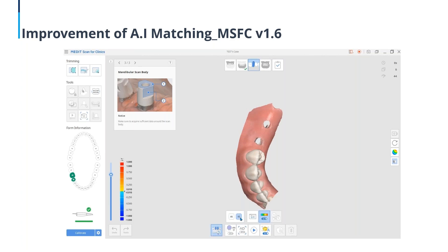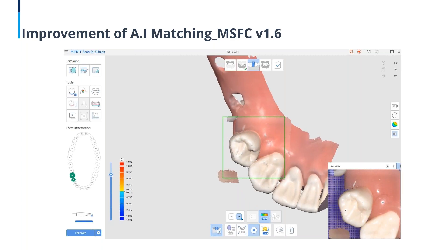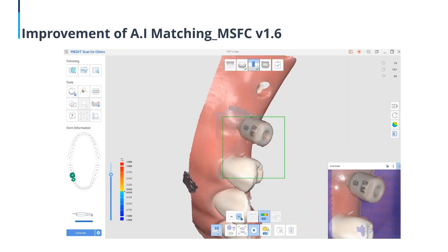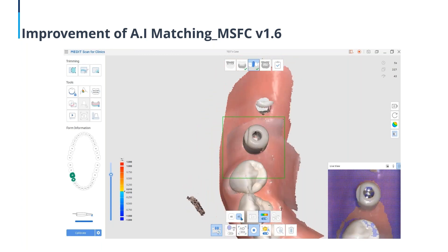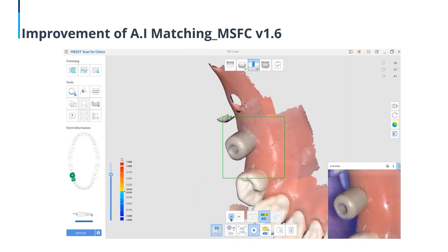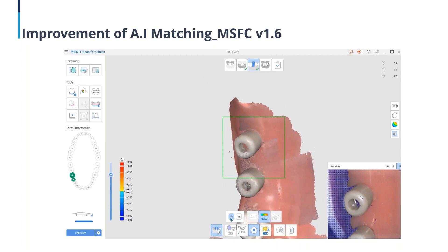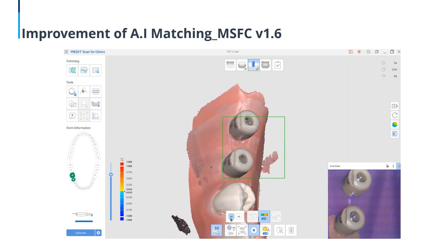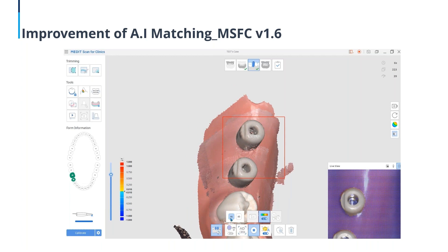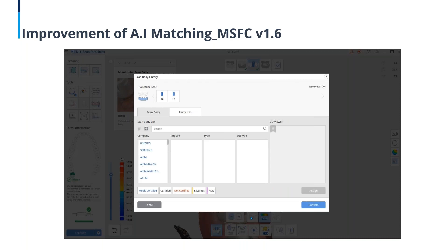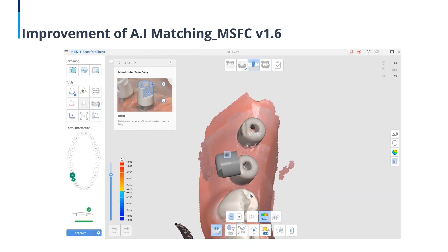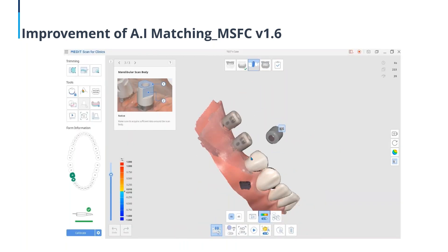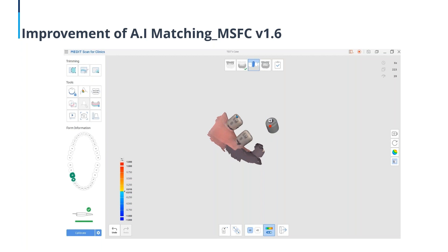Here you can select the tooth number. What you're going to do first is scan the scan body. And then once scanning that first scan body, we're then going to select the second scan body to scan. So you can see that we scanned each scan body only after selecting the tooth number. And then from here, we're going to come into the scan body library, select the scan body that we're using. You're going to see with the updated features here in just a minute, the library is more user friendly as well.